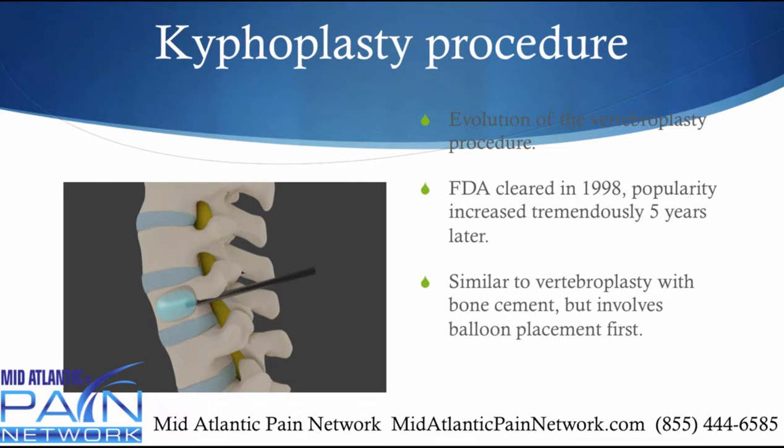The kyphoplasty is an evolution of the vertebroplasty procedure. So it was FDA cleared back in 1998, but it really didn't become very popular until about 5 years later. It is very similar to vertebroplasty as far as how the catheters are put into the bone, but what happens is a balloon filled with saline is inflated first, and then that's removed, and then a lot more cement is put in under much lower pressure than with the vertebroplasty.